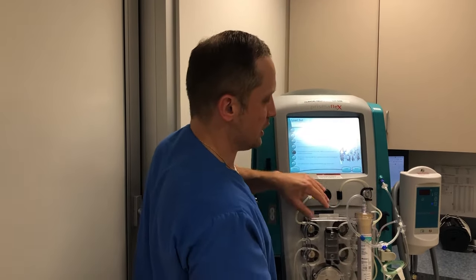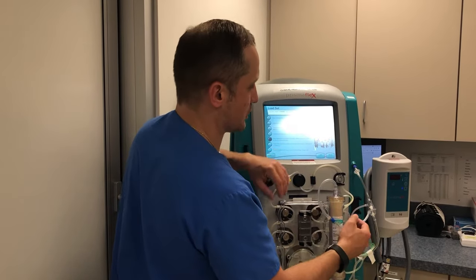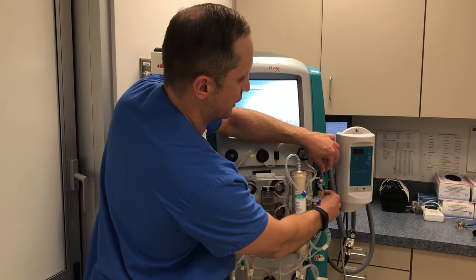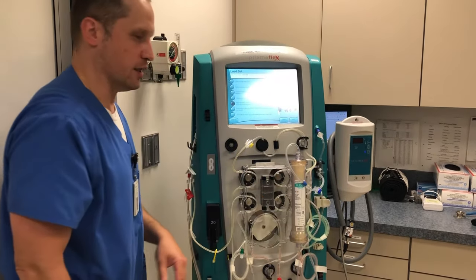Then you're going to place your deaeration chamber into its little holder. Always put the fat bottom in first and the skinny top second. And slide that right in there.